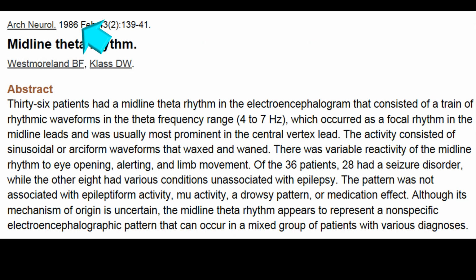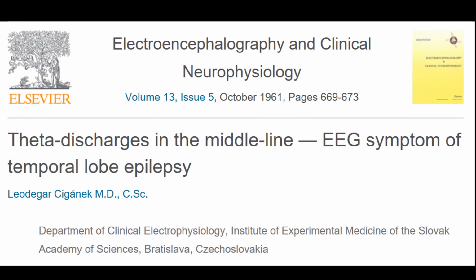Further reports in 1986 by Westmoreland and Klass regarding midline theta rhythm concluded that this was a non-specific pattern, and certainly it was not linked to epilepsy as it was originally reported.